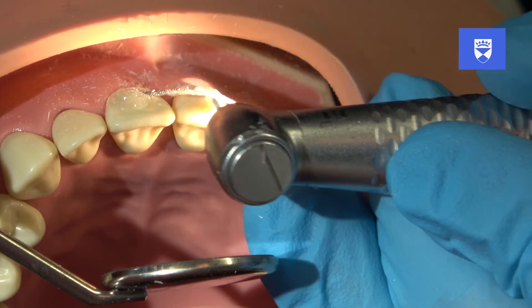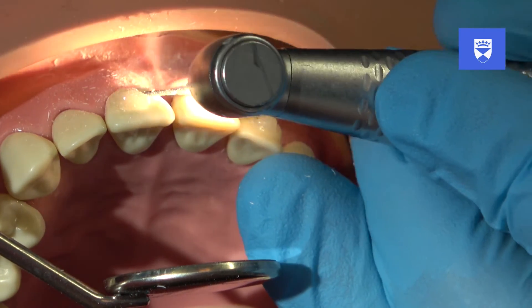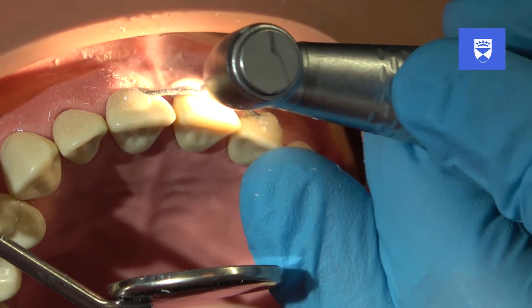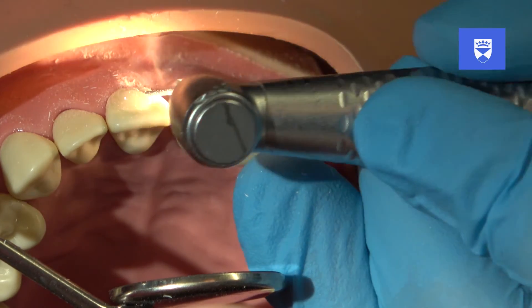Use minimal pressure and carefully allow the burrs to grind the composite. Regularly check your progress with composite removal. Once the traumatized tooth is debonded, the splint will still be attached to the mesial and distal abutment teeth.